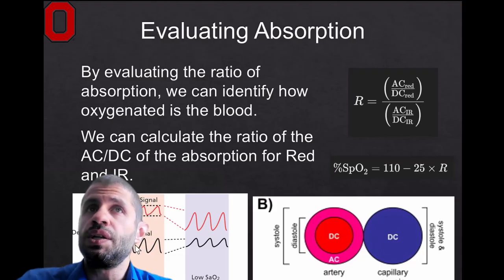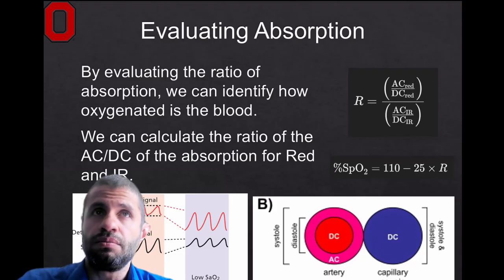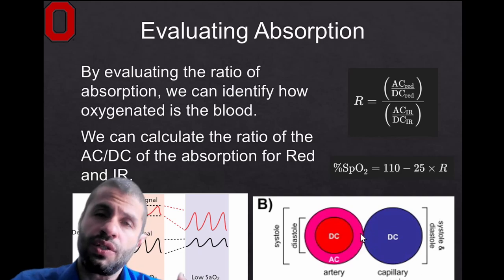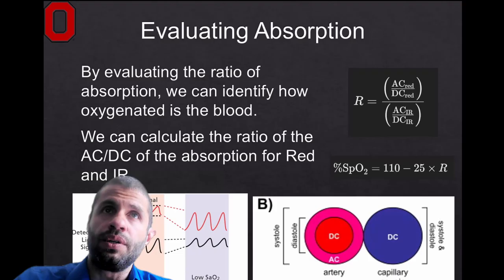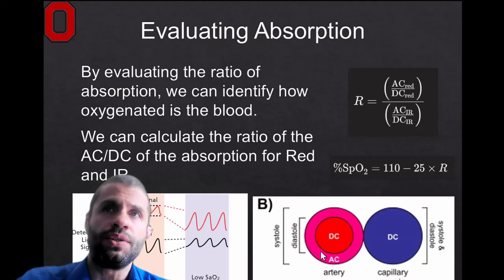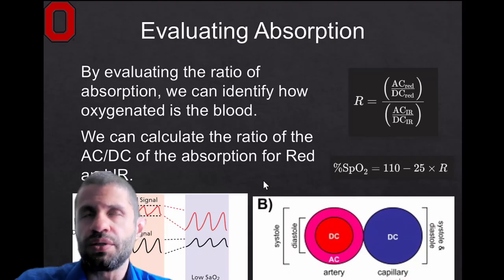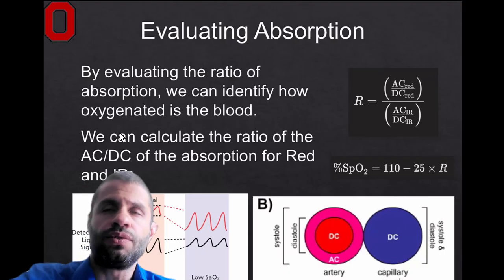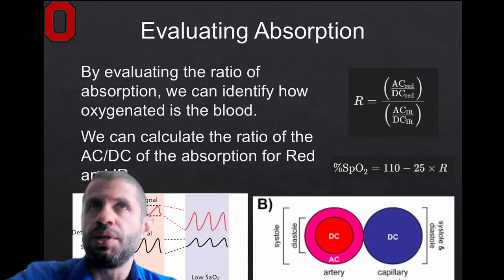So you'll notice that in this signal, there is a clear offset, meaning that the signal from the ground goes up. That is all the capillary, vein, tissue, anything that can get in the way that doesn't change, while the AC component or the alternating current component is going to be anything that does change. So that's just something to consider whenever you're seeing this AC/DC type definitions. And when we get into circuits, we'll talk about the actual definition of AC and DC when it comes to circuits and electronics. But in this case, it's just the variability.